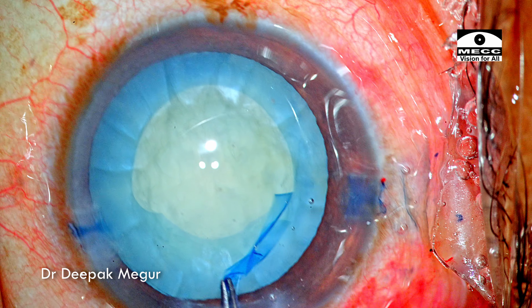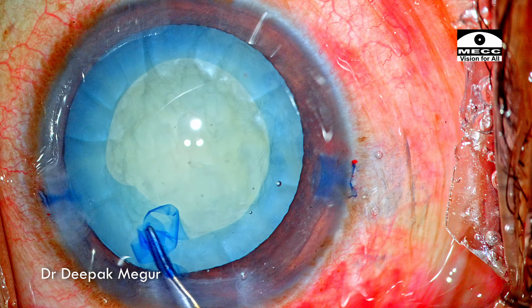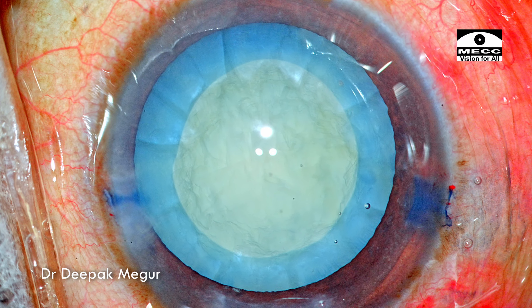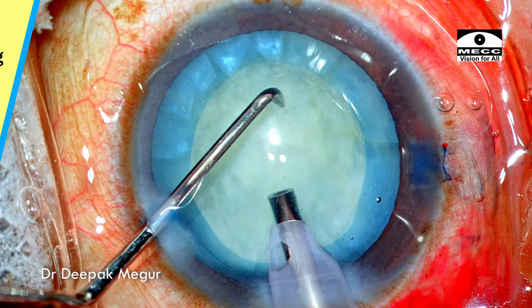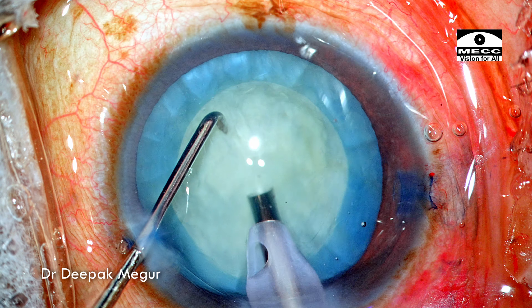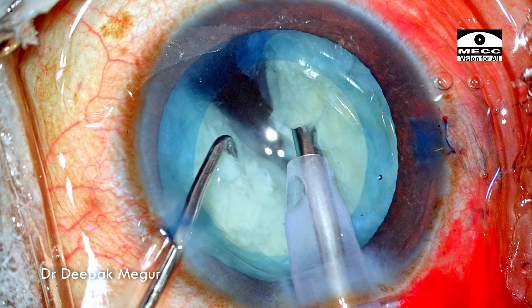We can note that once the bag is decompressed, the capsule behaves in a very predictable manner. For this case, the most critical step was the rhexis and the game is essentially over now. Nucleus management is going to be very easy since the nucleus seems quite soft. The plan is to do a direct vertical chop. These are the settings for the chop mode — I was anticipating a very soft nucleus, so the power is set low: 15% longitudinal only while chopping. The tip is buried in the substance of the nucleus.